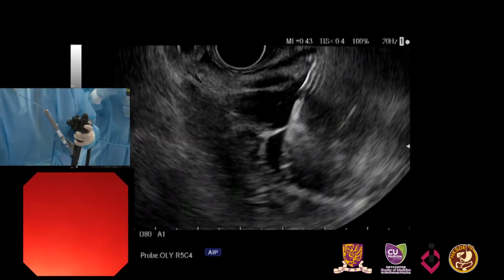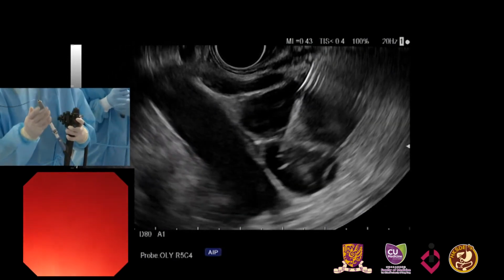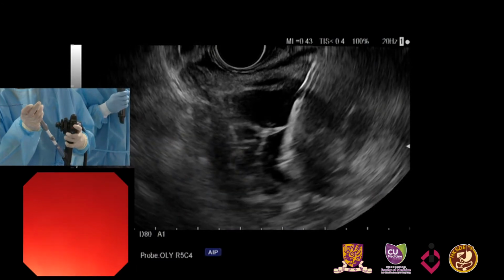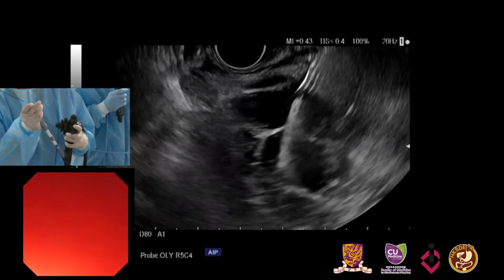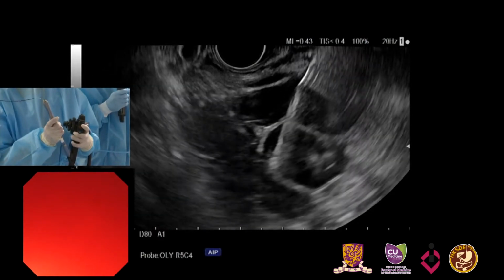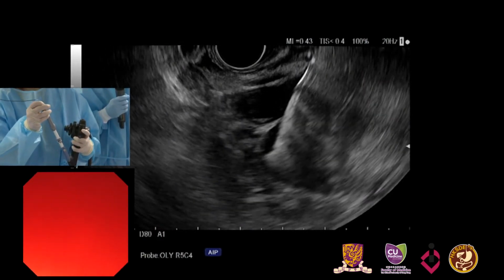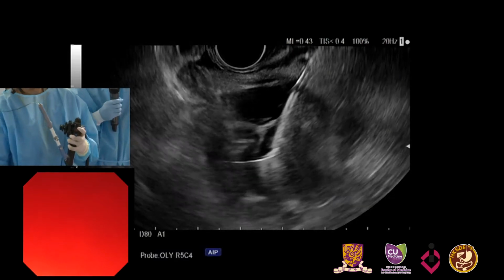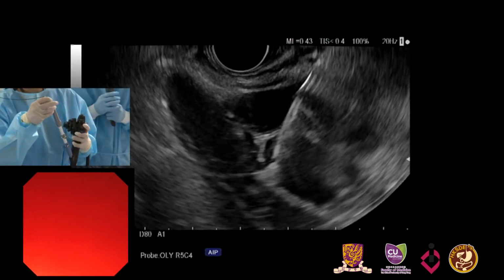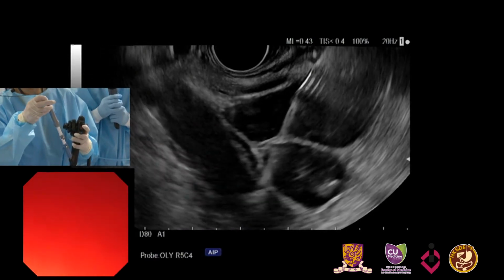But nowadays we have, as you see here, confocal endomicroscopy and also Moray forceps intracyst cyst wall biopsy. So we have many other armamentarium to get a better differential diagnosis here. So you can see, hopefully I'll try to zoom up, you can see the forceps coming out of the needle tip there. And they open and then close.